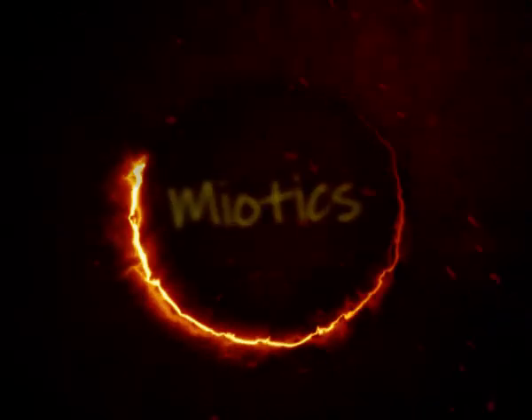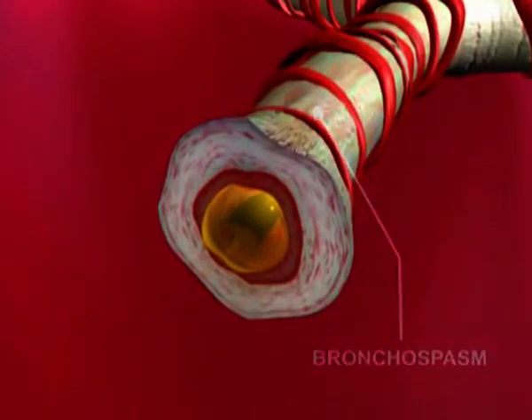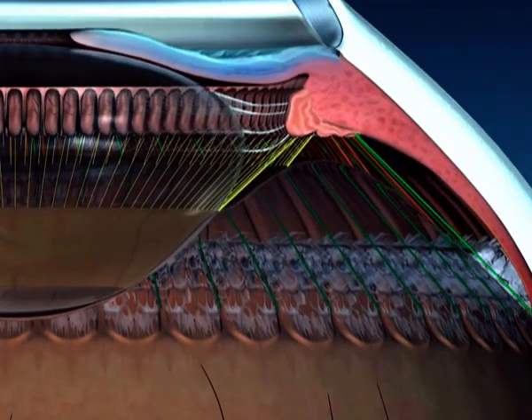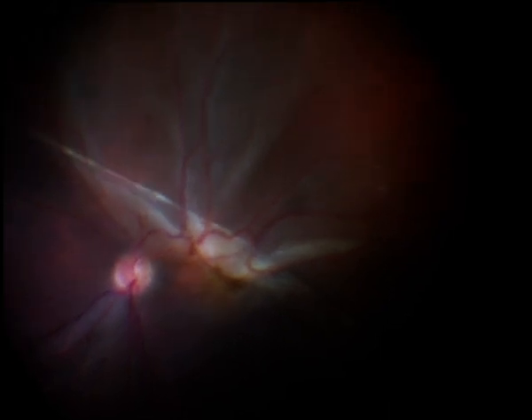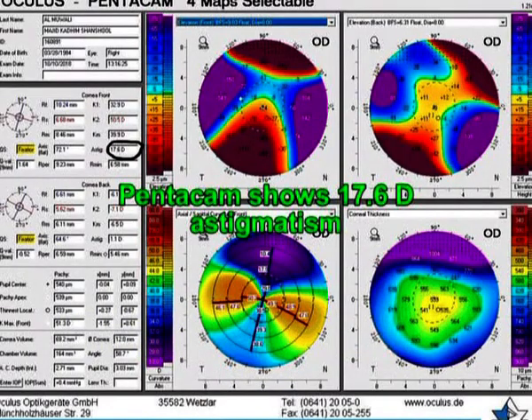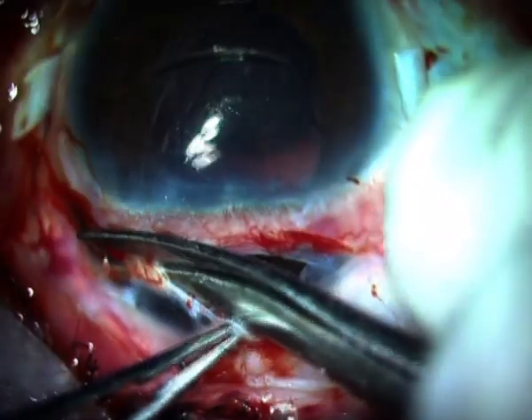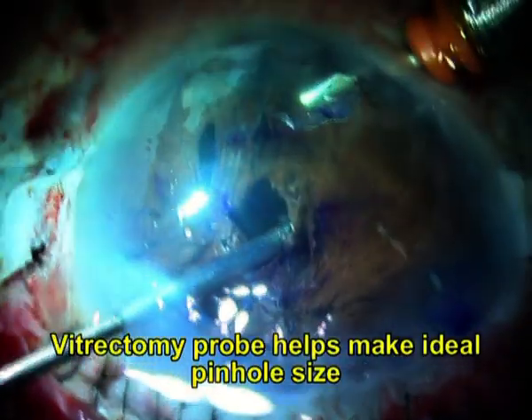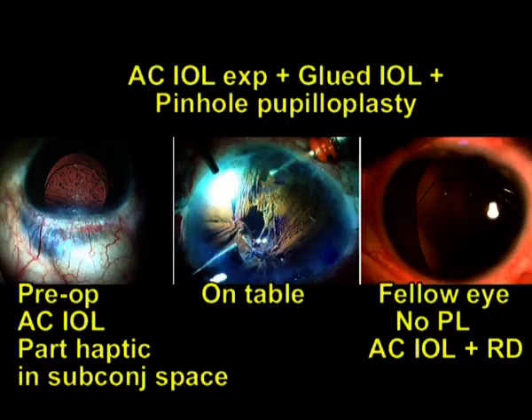Miotics have been recommended, although they are associated with drawbacks like frontal headache, nausea, and bronchospasm. Prolonged use of miotics can lead to ciliary muscle spasm that may induce retinal detachment in myopic eyes. A one-eyed patient having an ACIOL which had partly eroded through the subconjunctival space with high astigmatism was explanted and a glued IOL performed with pinhole pupilloplasty.